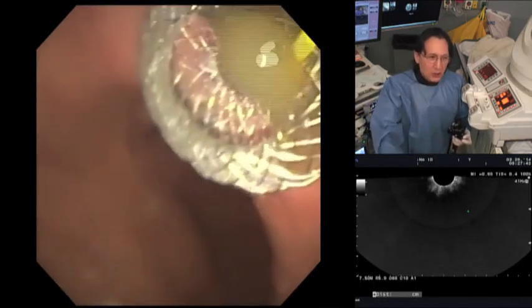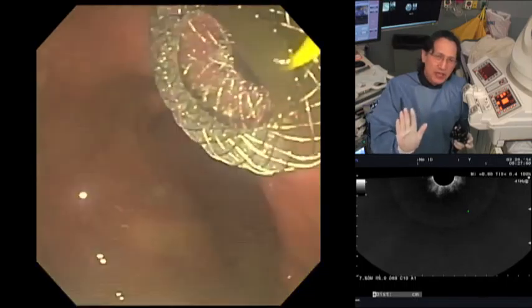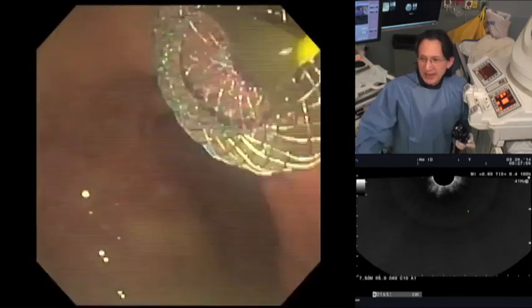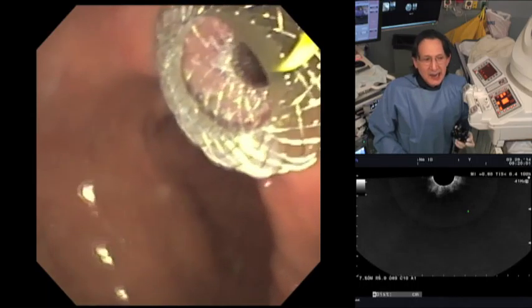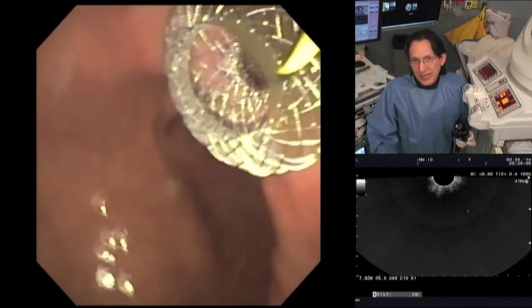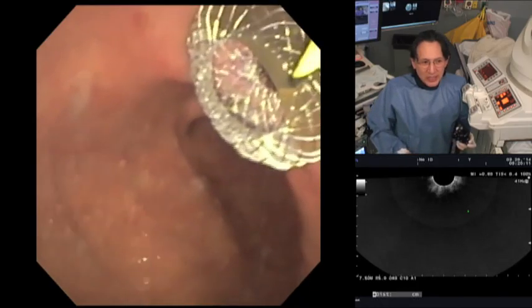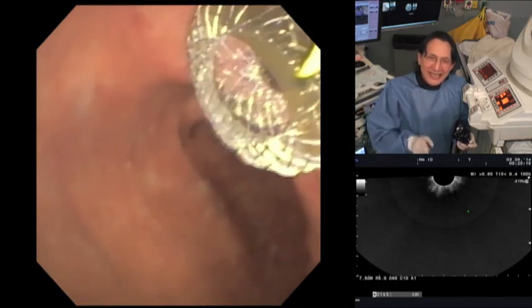So we're going to dilate this tract now very quickly to 10 millimeters. This is a 10 millimeter stent. And as you said, Paul, you could have used a 15. It's just that we've got some 10s that we use for the gallbladder and we use for the bile duct. And we'll use it for pseudocysts that have only fluid collections. And then we have the 15s that we use for cysts with necroses. What I'd like to do is go over to Dr. Bhatt's room, Yasser's room now, and then I'll have you come over to me in a moment when I go inside of the cyst to look inside.